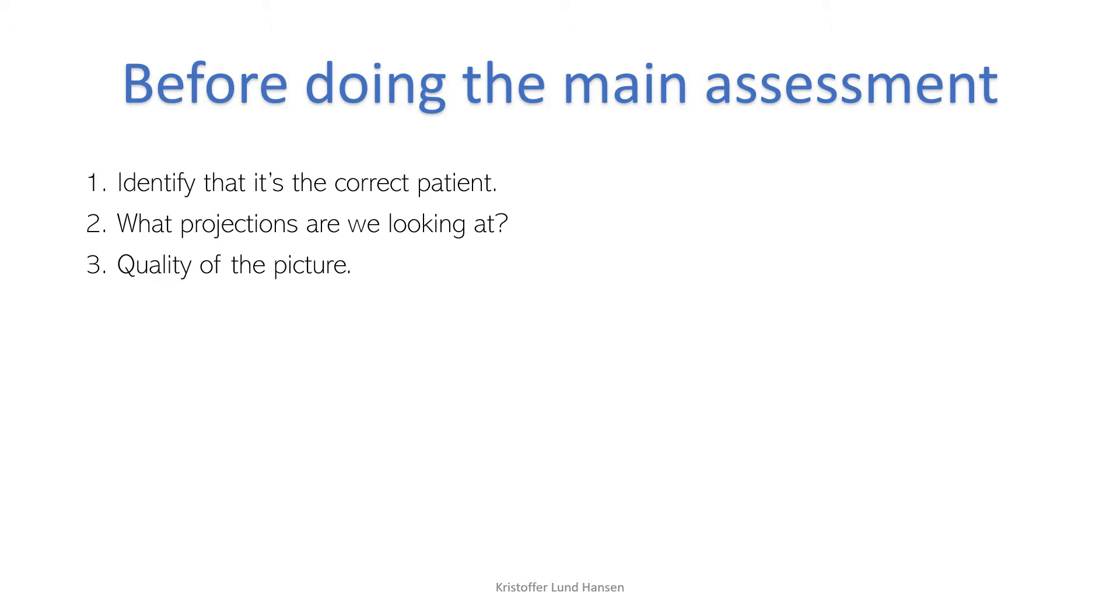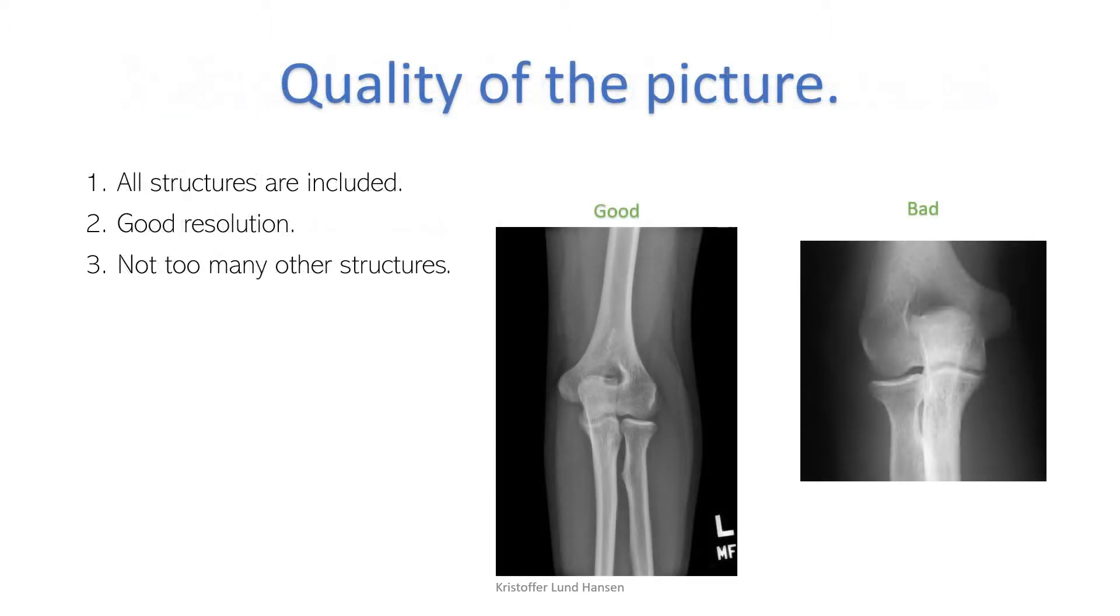Lastly, we check the quality of the picture. To assess the quality, you have to look at three things: all structures should be included, your impression of the resolution should be good, and it should not include excessive parts of the body taking away from the area of interest. The x-ray to the right here is bad due to it being too zoomed in.